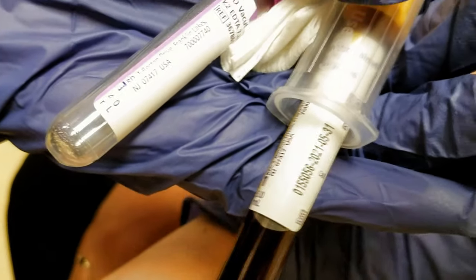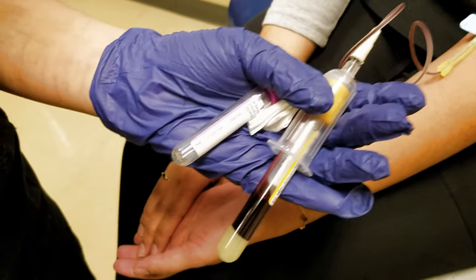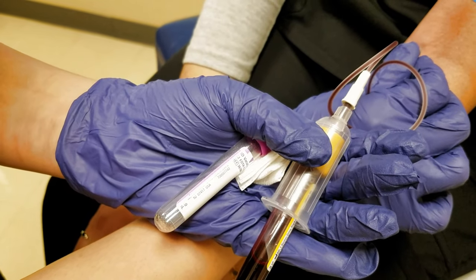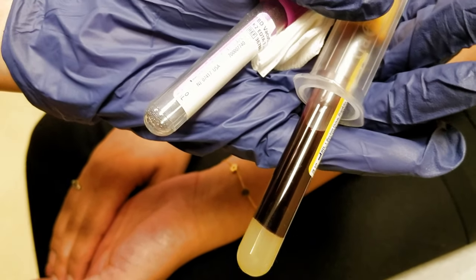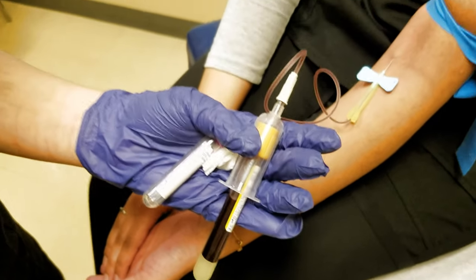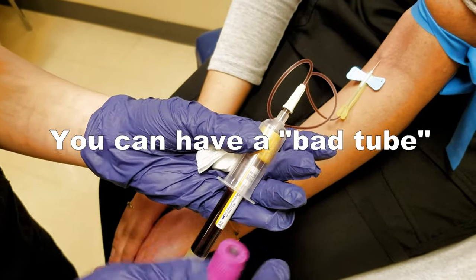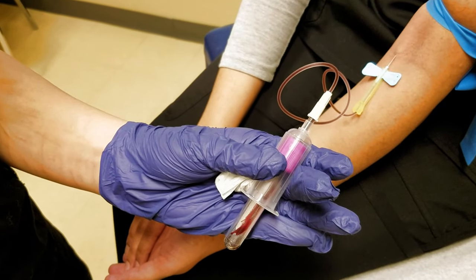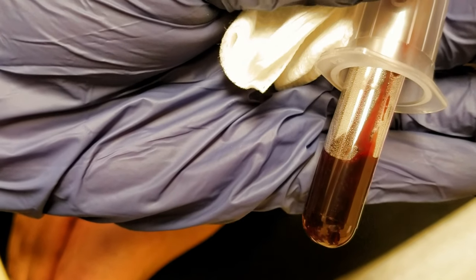What was happening is the vein decided to contract a little bit and tried to push the needle out. Just let go of it and do it again — just a millimeter. Just let it go. If it's slow, that's okay — it's filling up and it's almost done. Another thing that can potentially happen is that your tube has lost its vacuum. If you've adjusted everything and you're still not getting any blood and you think the needle is in the vein, switch tubes. If you switch tubes and still no blood, then it's a needle-vein problem and not a vacuum problem. It's okay if it goes slow — if you're just drawing a couple of tubes, let it do that and don't mess with it, because you don't want to make your needle worse.